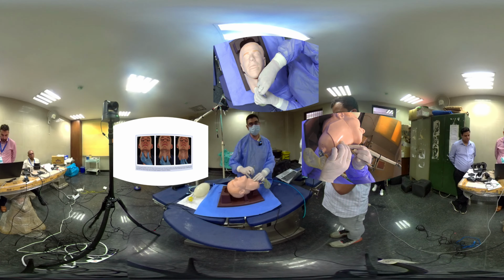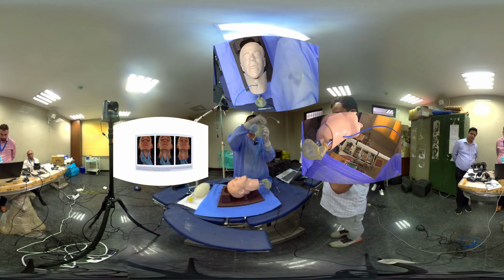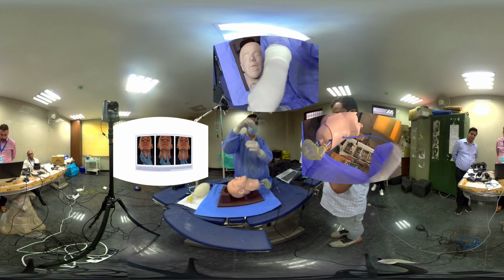The bougie has to go around 10 to 15 centimeters. There are markings on the bougie. So it goes around 10 to 15 centimeters in the trachea. Once the bougie is there, I remove the scalpel. Once the scalpel is removed, now I have to railroad my tube. So I take the cuffed size 6 tube and then railroad it over the bougie.